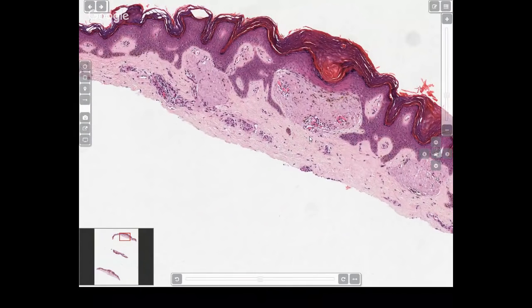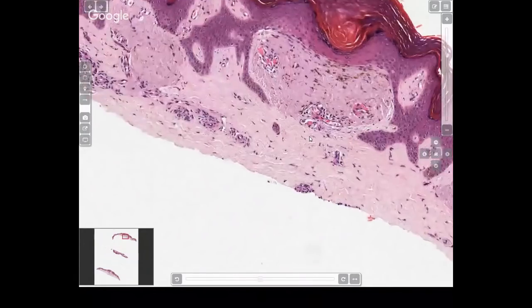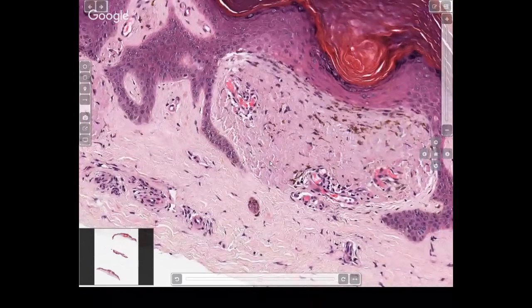When you think of amyloidosis, you go high power and you scan the dermal epidermal junction. And if you look at it at high power, then you're going to see this very classic pink hyaline deposition at the dermal epidermal junction. And this is amyloidosis. You can highlight it with Congo red. And because this is keratin derived amyloid, derived from keratin degeneration, you can also use CK903, a keratin immunohistochemical marker that is going to highlight the keratin derived amyloid. So whenever you see pigment incontinence, think amyloid, go high power, scan the dermal epidermal junction and look for these pink hyaline deposits. If you see them, then your diagnosis is lichen amyloidosis.